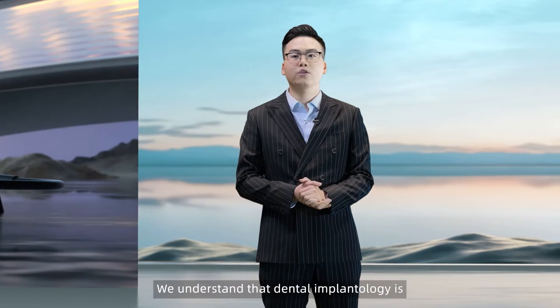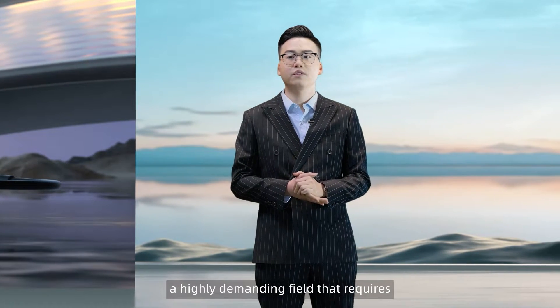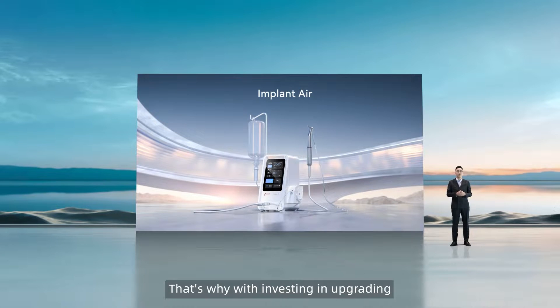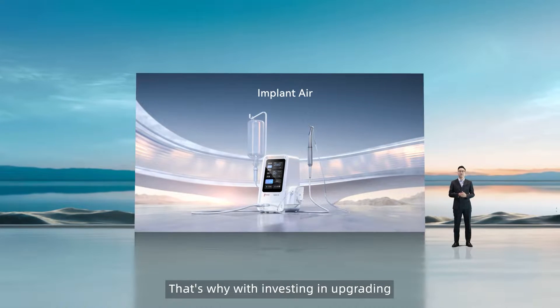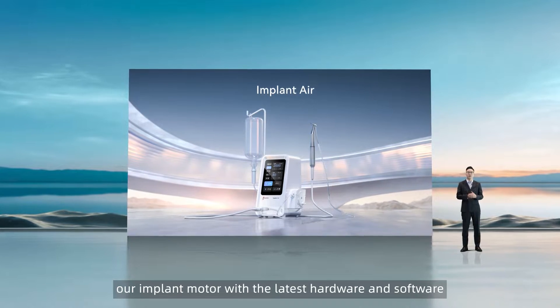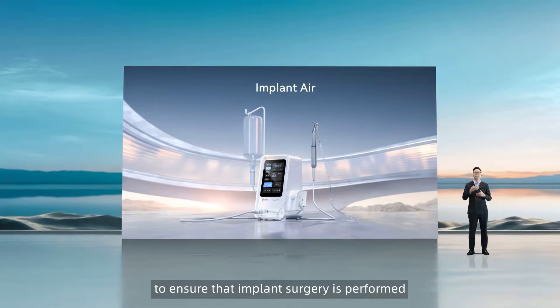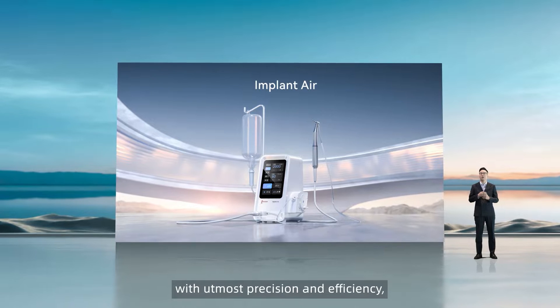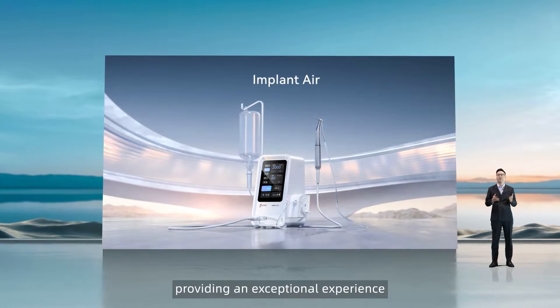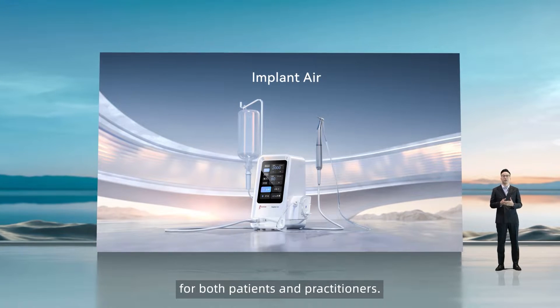We understand that dental implantology is a highly demanding field that requires precision and accuracy. That's why we've invested in upgrading our implant motor with the latest hardware and software to ensure that implant surgery is performed with utmost precision and efficiency, providing an exceptional experience for both patients and practitioners.